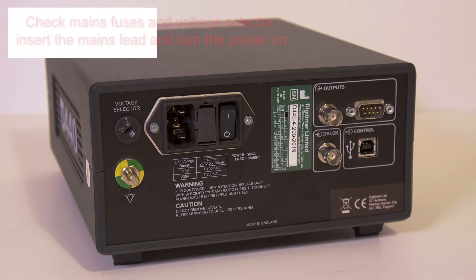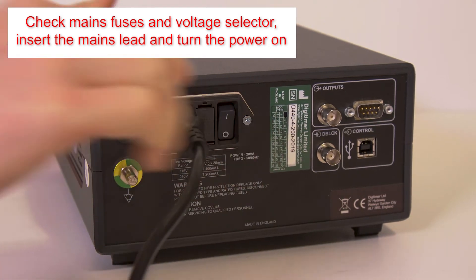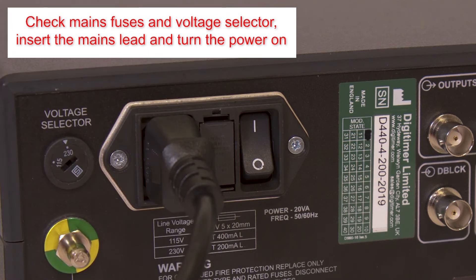Before use, please ensure the mains fuses and voltage selector are appropriately rated and set for your supply voltage. Then insert the mains lead and turn the power on.